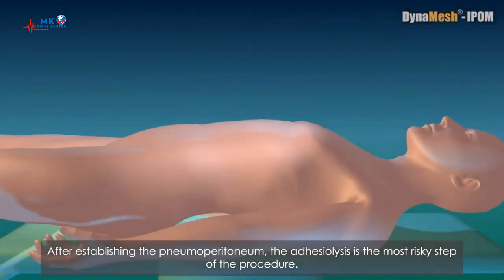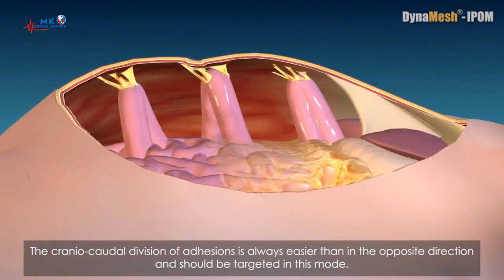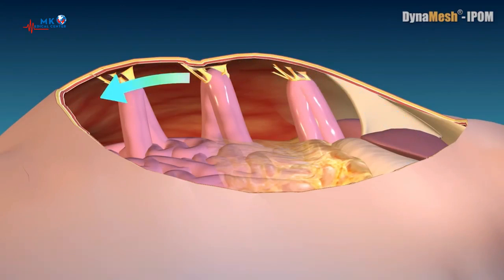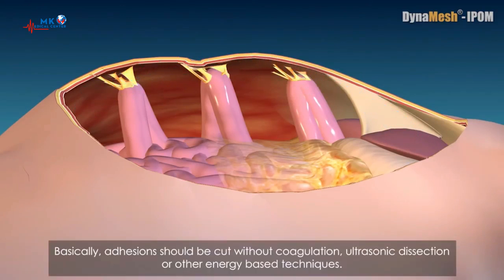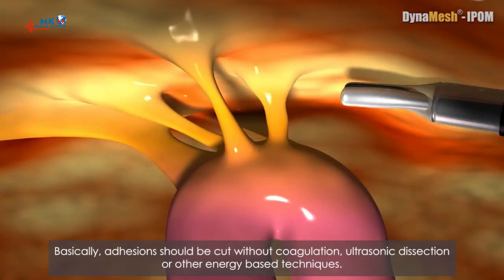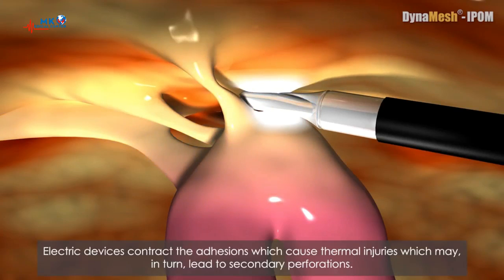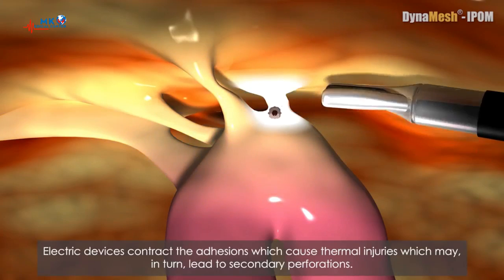After establishing the pneumoperitoneum, the adhesiolysis is the most risky step of the procedure. The craniocaudal division of adhesions is always easier than in the opposite direction and should be targeted in this mode. Basically, adhesions should be cut without coagulation, ultrasonic dissection, or other energy-based techniques. Electric devices contract the adhesions, which causes thermal injuries, which may in turn lead to secondary perforations.